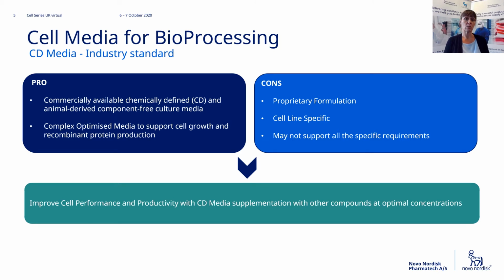However, their composition is usually proprietary and unknown for the user. When used for a specific cell line, CD media may not support all its specific requirements, and therefore additional supplementation with other compounds at optimal concentrations may provide substantial improvement in cell performance. There are different approaches to media optimization.